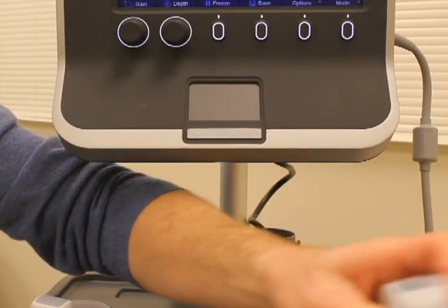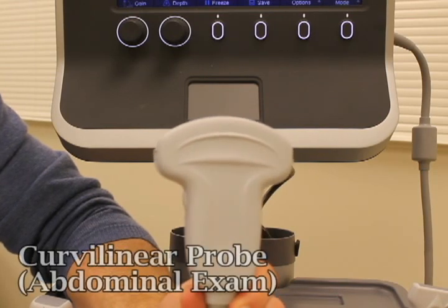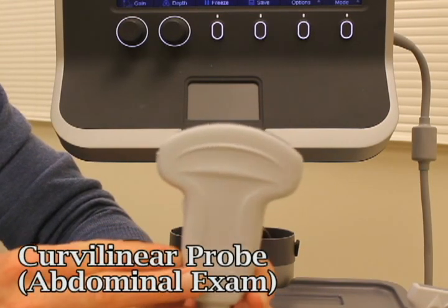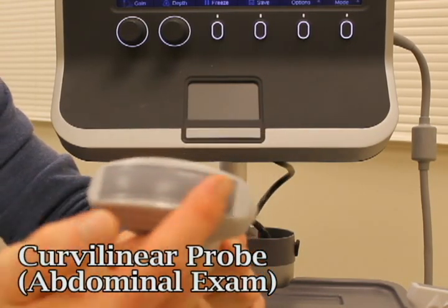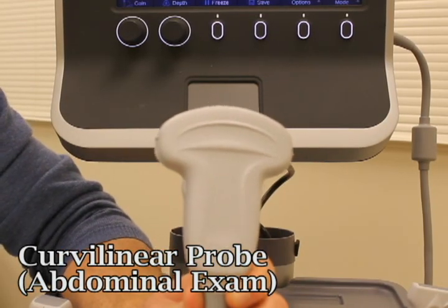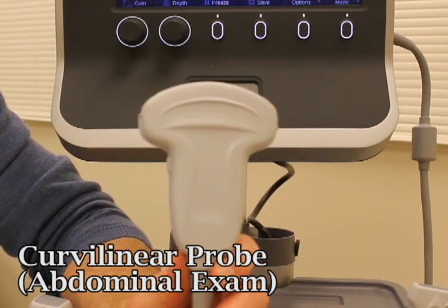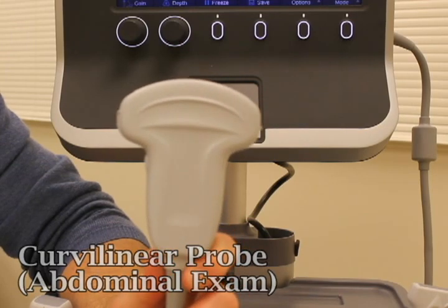The next probe is referred to as the abdominal probe, or its technical name, the curvilinear probe. This gives you a much broader depth of field because it has a very wide footprint and very low-frequency ultrasound beams, giving you a lot of depth — you can see up to 30 centimeters into the body. This is a great probe if you want to look at the liver, the kidneys, or other structures in the abdomen.